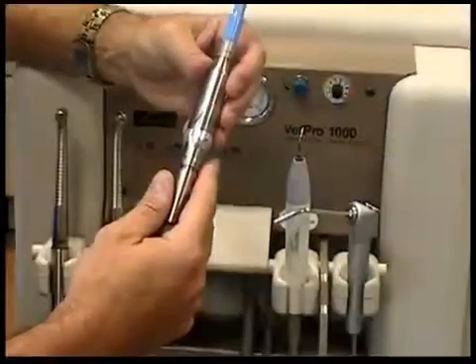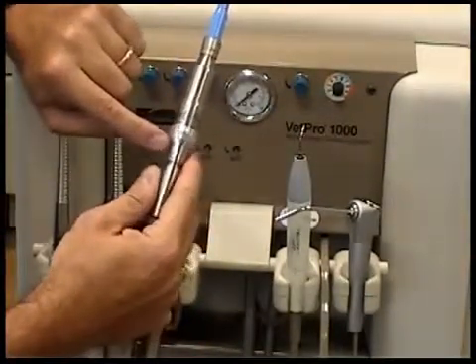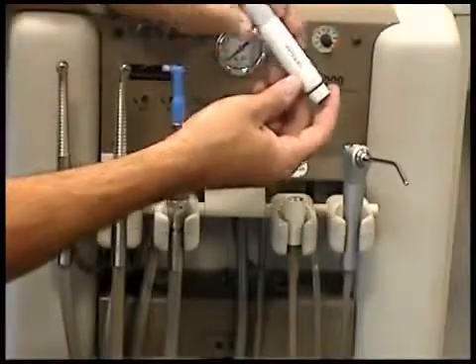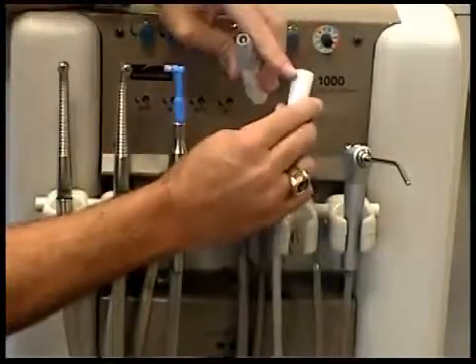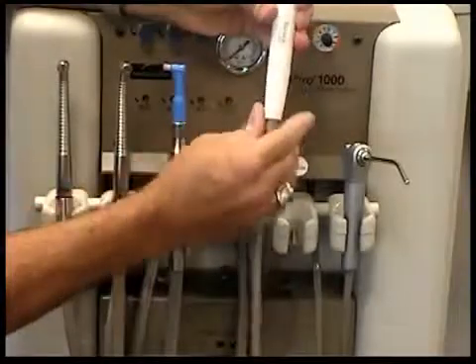Near the top of the handpiece, there is also a locking dial. Turn it down to install the prophy angle. Turn it up to lock the prophy angle onto the handpiece. Finally, we have the scaler, typically used for removing calculus from teeth. To properly install, match the dots located on the sides of the scaler and the hose. Attach the scaler to the hose as shown.